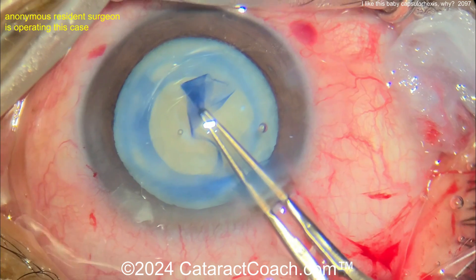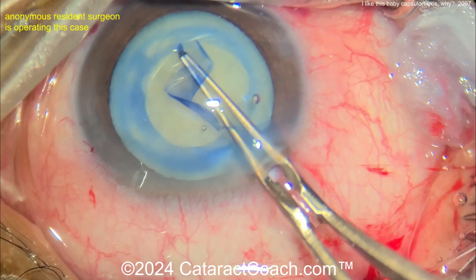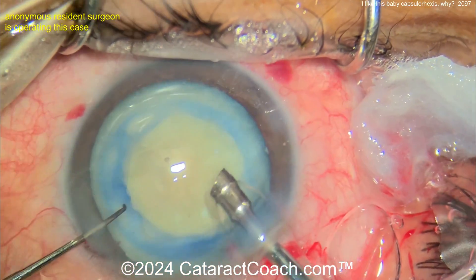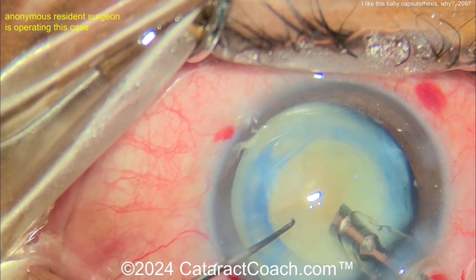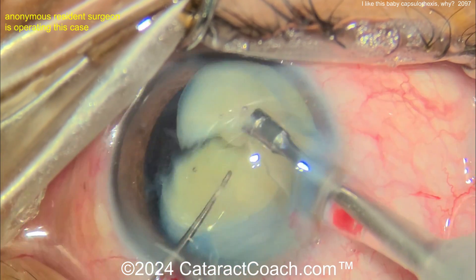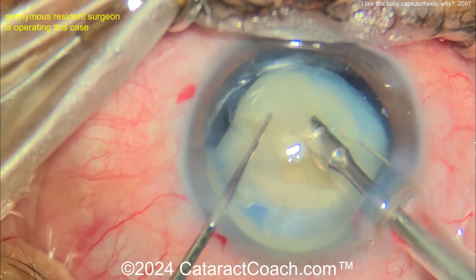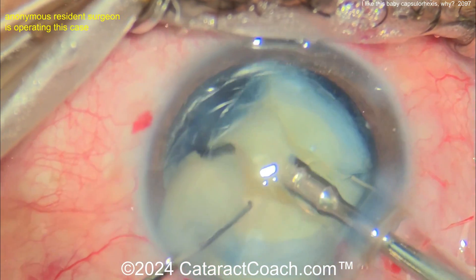This case is going to be done with phaco. A lot of times these white cataracts — if there's no brownish tint to them — are really not that dense. Going with the phaco probe here, and there's a Sinski hook in the other hand for some chopping action. The phaco probe buried in the nucleus and the chop going there. You can see the capsule bag is lacking any cortex. Good chop there, and then another chop. I like the technique here, chopping with that little Sinski hook — that works pretty well.